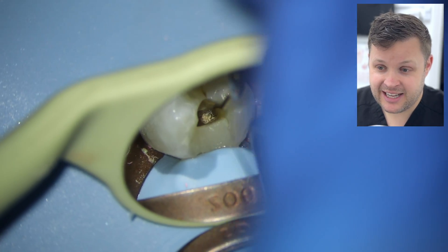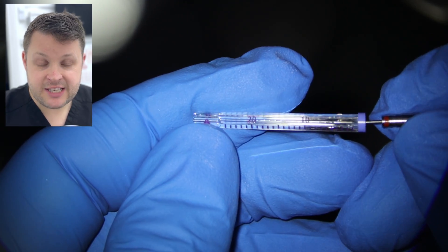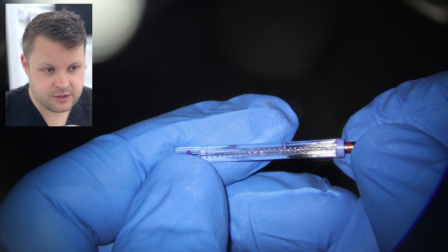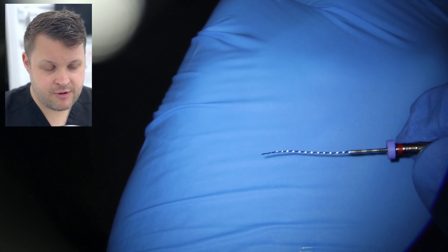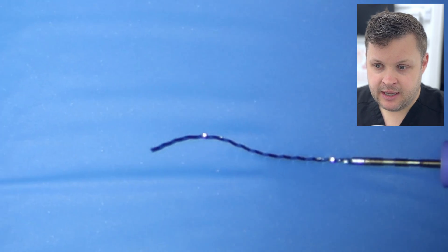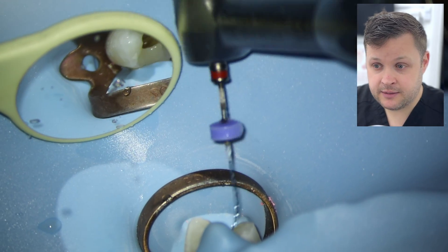Now for the magic file — the XP-endo Finisher. While warm, this file has a crescent or half-moon shape. Because of its unusual shape, you use a plastic sleeve to set the length, since you can't easily measure it on a normal endo ruler. We use Endo Frost to cool the file within the sleeve — as we remove it, it has a straight shape. When I place it in the warmth of my hand, it moves back into the crescent-moon shape. We're going to use it at a high RPM: 800 rpm.